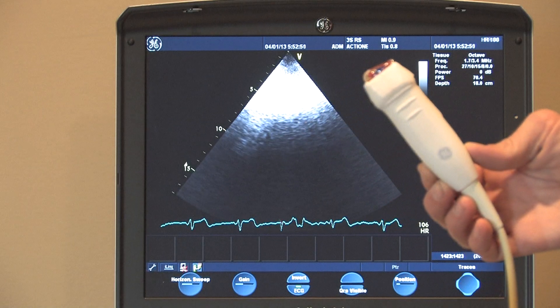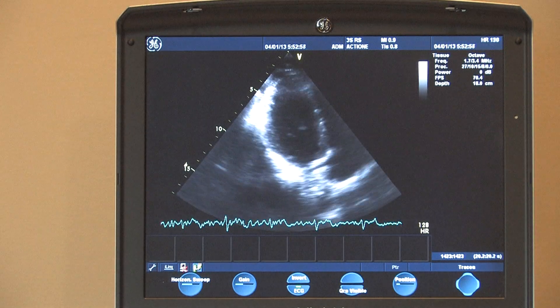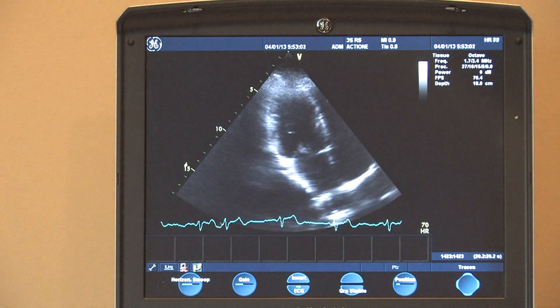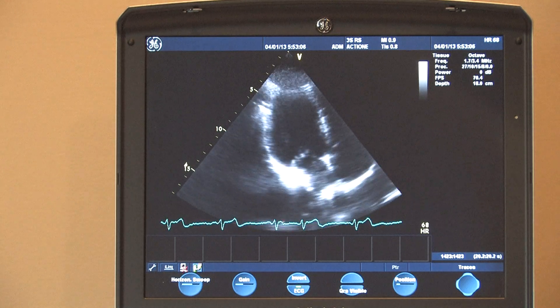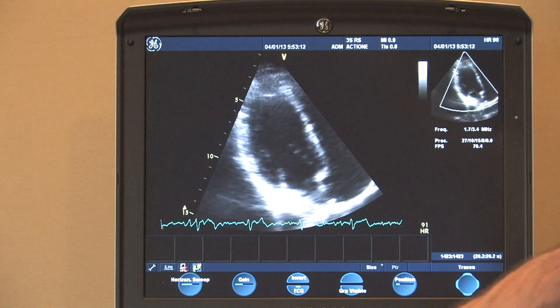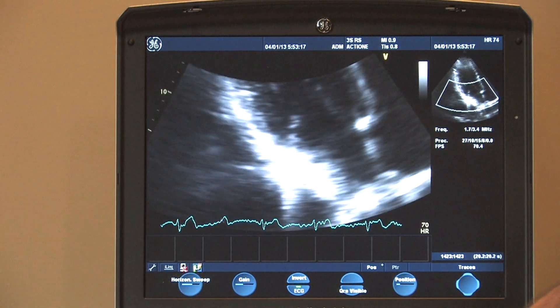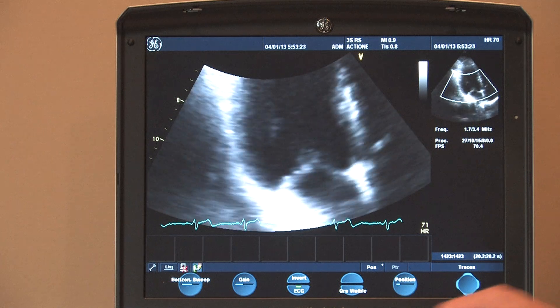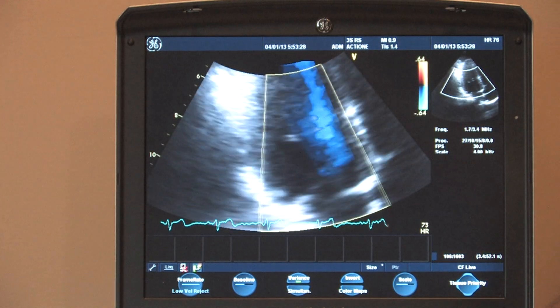This is a demonstration of the cardiac imaging probe — it is a 3S RS cardiac probe. It works with no problems, as you can see as I'm imaging myself here. I'll go on to demonstrate a couple of functions of the probe. Zoom works fine. The color flow works fine and can be manipulated.